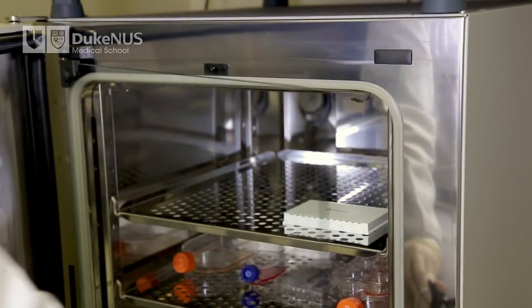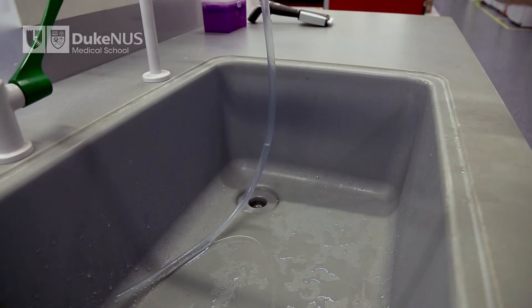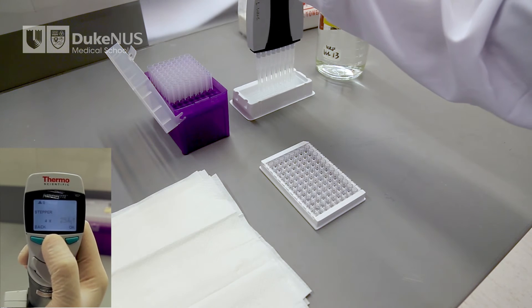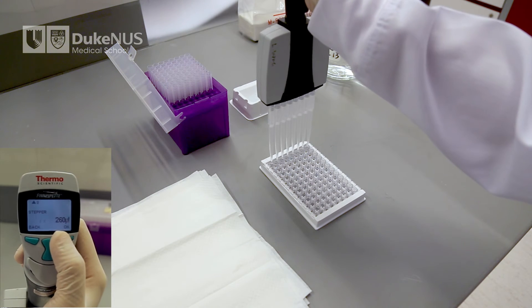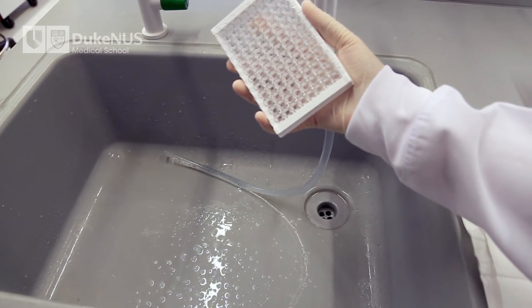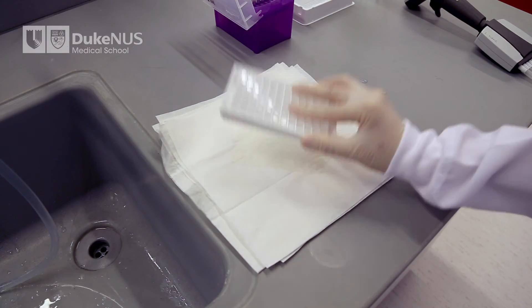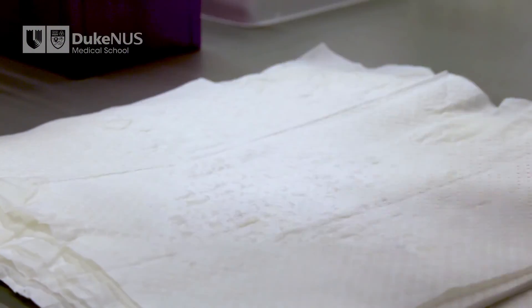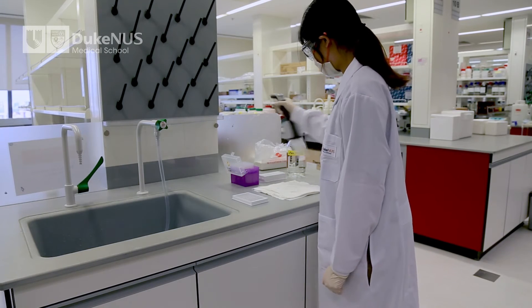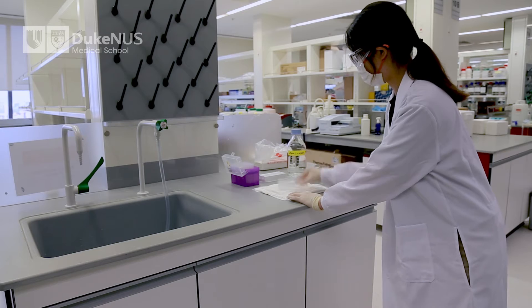After the 15-minute incubation, remove the capture plate from the incubator. Invert to remove the sample mix from the plate. Wash each well with 260 microliters of the one-time concentrated wash buffer. To remove the wash buffer, tip the plates over a sink and tap the plates on a stack of paper towels to dry. You may also use a microplate washer or multi-channel pipette to remove the wash buffer. Wash the plates three more times. After the fourth and last wash, tap the plates dry before proceeding.